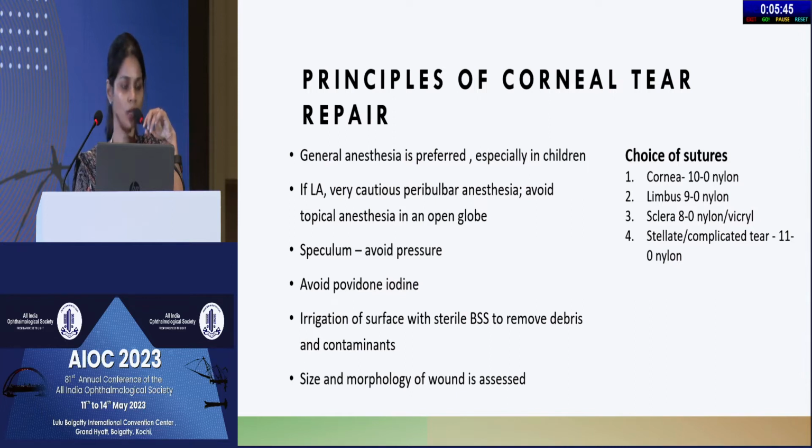If it's a corneal tear, we prefer a monofilament 10-0 nylon, for the limbus 9-0, for sclera 8-0 nylon or Vicryl, and for stellate or very minute tears, we can use 11-0 nylon.